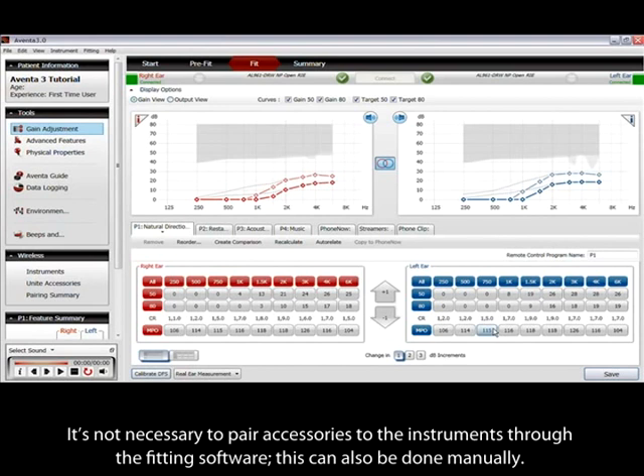It's not necessary to pair accessories to the instruments through the fitting software. This can also be done manually.